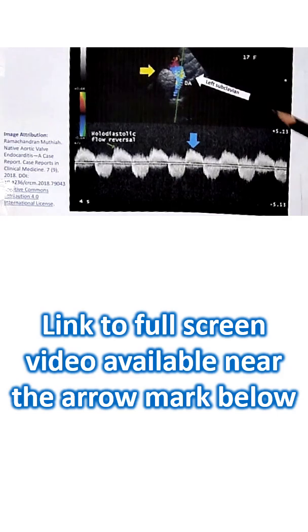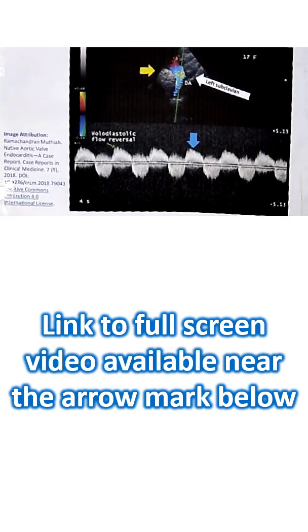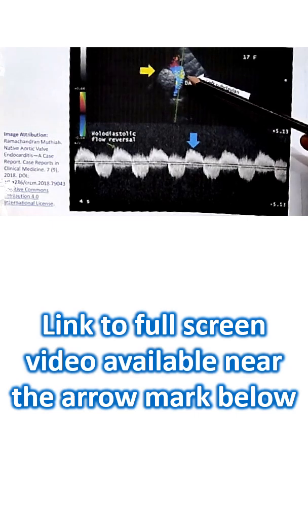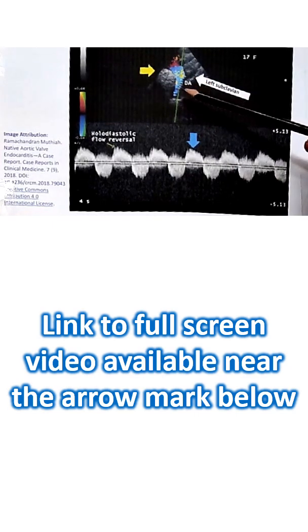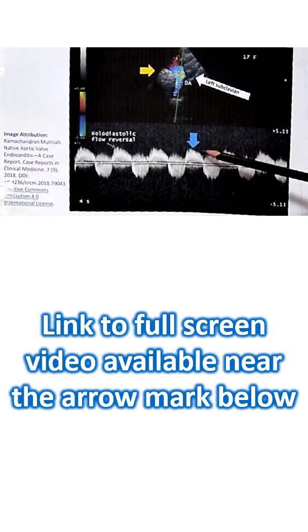In severe aortic regurgitation, there will be significant flow reversal in descending aorta. Usually you expect forward flow in descending aorta. This is flow reversal and the cursor is placed just beyond the left subclavian artery. This is the suprasternal view and this is the tracing which you obtained.